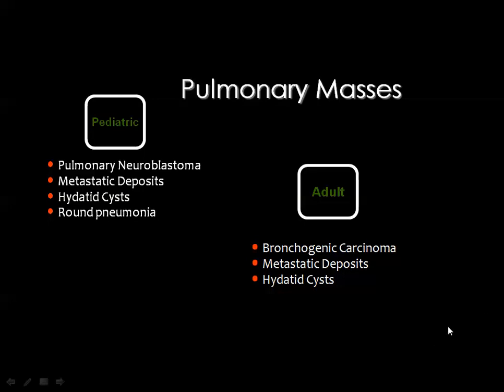Then we came to the pulmonary masses. I used to make this comparison between masses in adults and masses in the pediatric age group, and also nodules in adults and nodules in the pediatric age group.